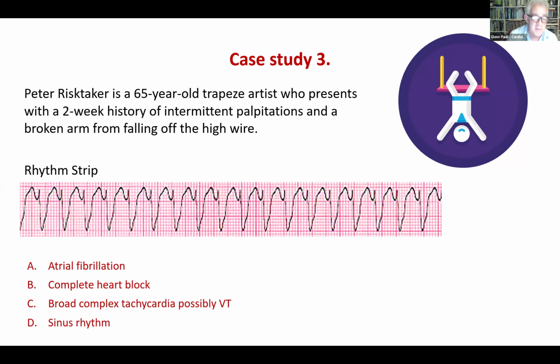It might be that person. But most of the time, if you revisit it and think, okay, I'm starting from scratch, I'm cleaning the skin, I'm getting new electrodes, I'm going to take my time, I'm going to tell them to relax, I'm going to make sure they're not shivering, make sure they're warm. Those sort of things are the troubleshooting issues. Whether that's going to solve 100% of the problems, probably not, but it should solve 99% of the problems.